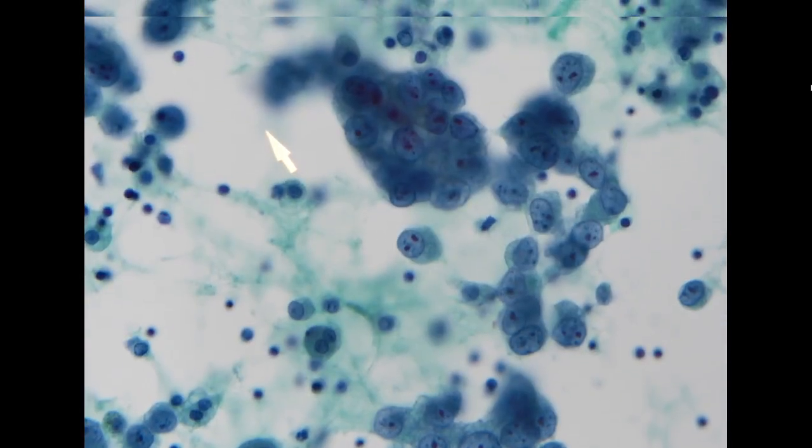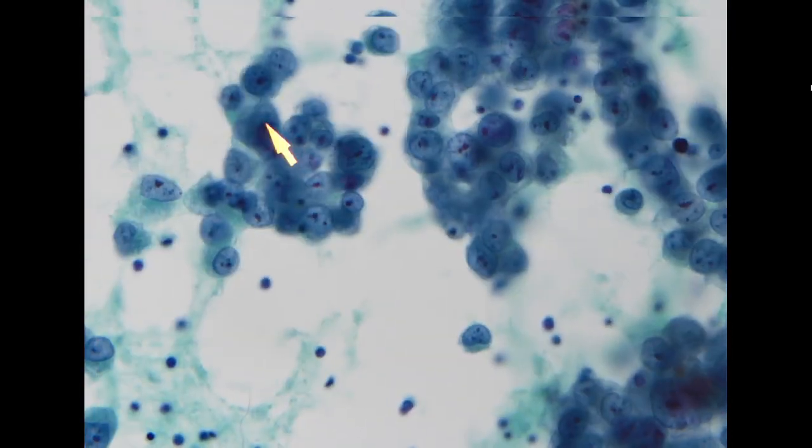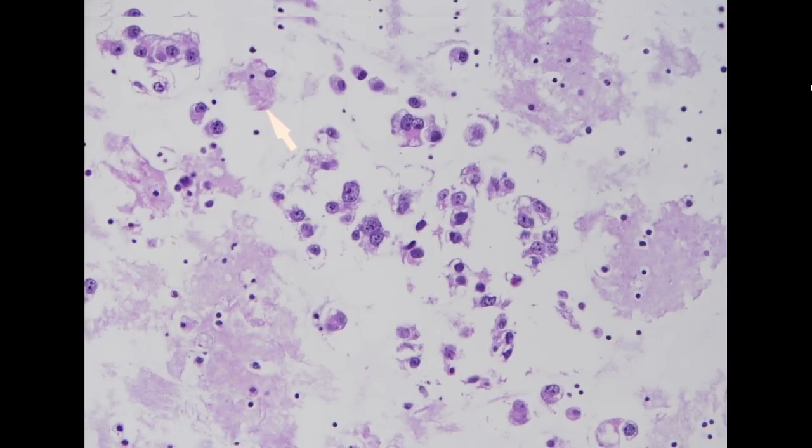The patient does have a history of lung adenocarcinoma, which has been proven to be TTF1 positive. So this is consistent with persistence or recurrence of the disease. If you take a look at the cell block preparation, it shows a very similar morphological pattern.